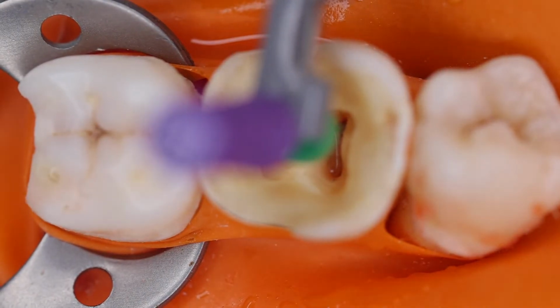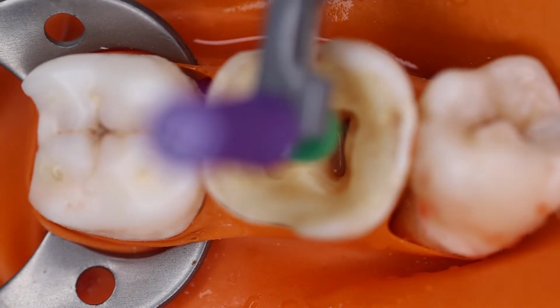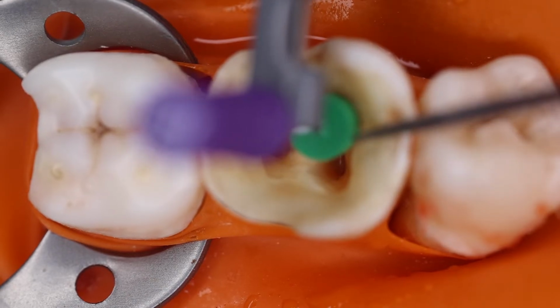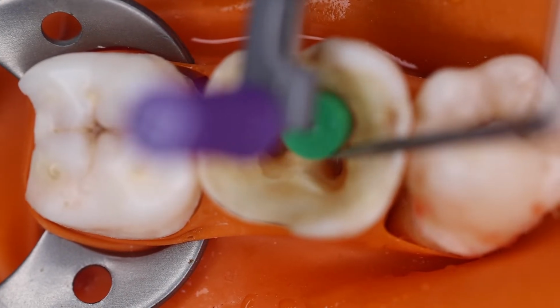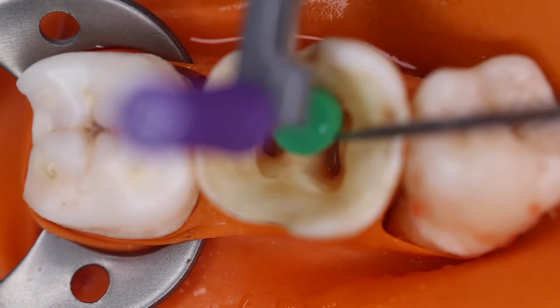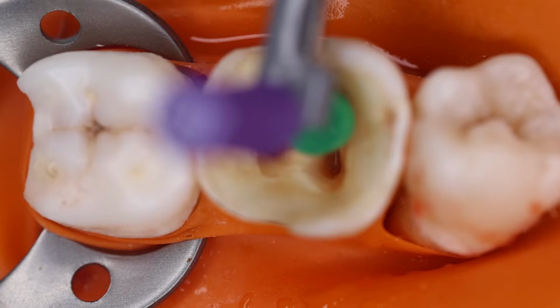Then the mesolingual canal orifice, we need to adjust the stopper over here. Roughly by 1 mm we have reduced it, so it is coming out to be roughly 18 millimeters.